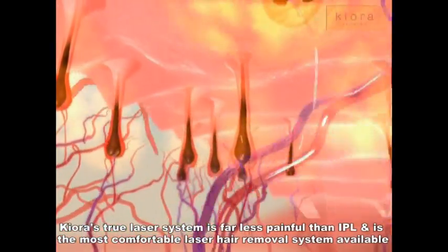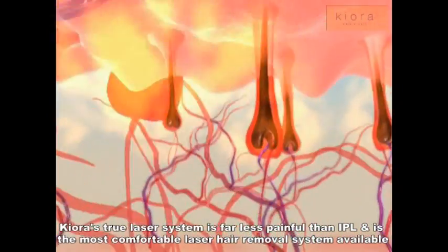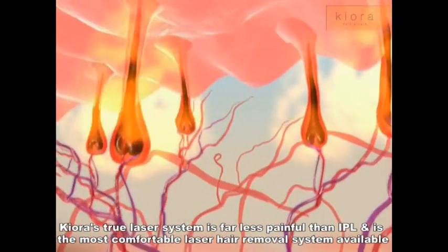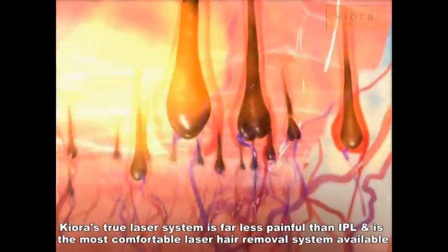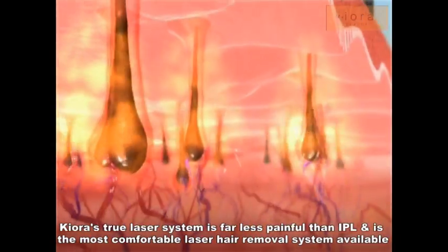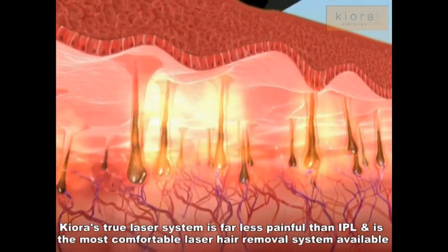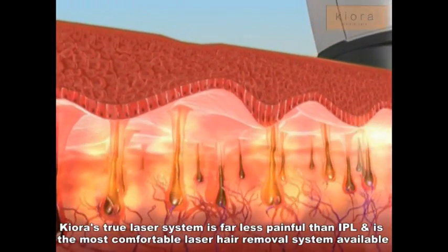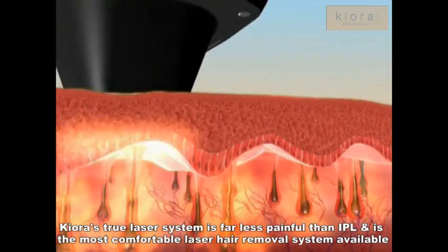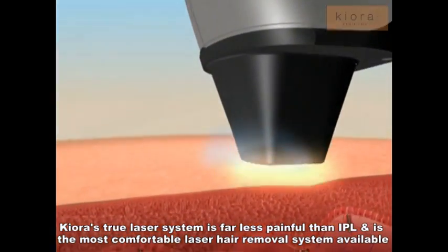The SHR mode utilizes a series of low-fluence, high-repetition pulses to increase the temperature of both the hair follicle and the surrounding nourishing tissue to 45 degrees Celsius. This more gradual, in-motion heat delivery uses the chromophores in the surrounding tissue as reservoirs to effectively heat up the hair follicle. This, along with the heat energy absorbed directly by the hair follicle, damages the follicle and prevents regrowth.